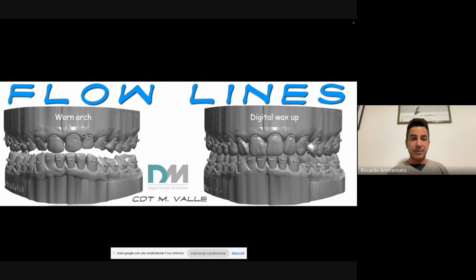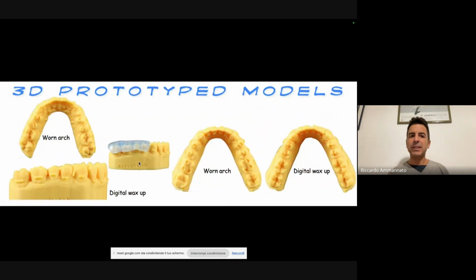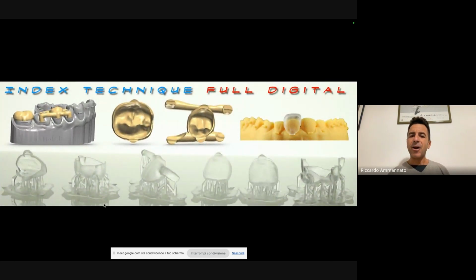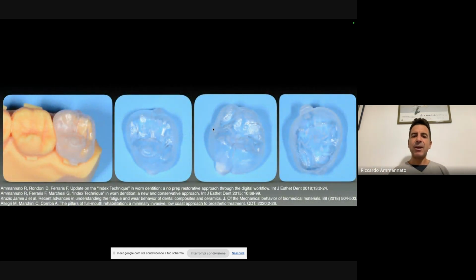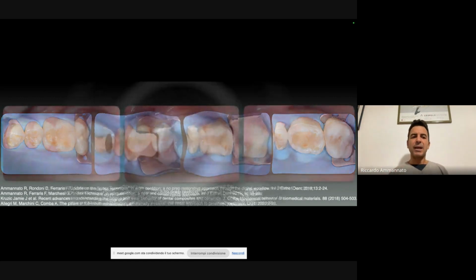On the STL files, the technician is delivering also all the flow lines, and we have them also on the 3D printed models, the prototypes, and we have here some samples of these 3D printed keys, okay, transparent keys. Here I'm using one of them. So in the last years we are using this kind of keys, but also we are still using the silicone ones, which are very, very good, but this is a very good option. And this is again the copy-paste approach, one by one, that we are delivering.